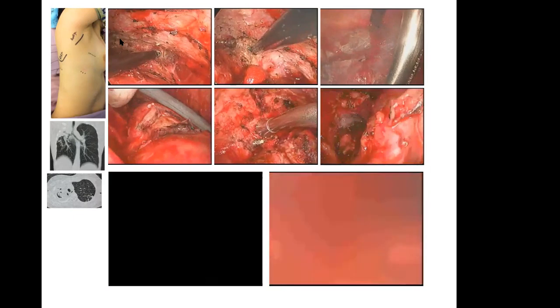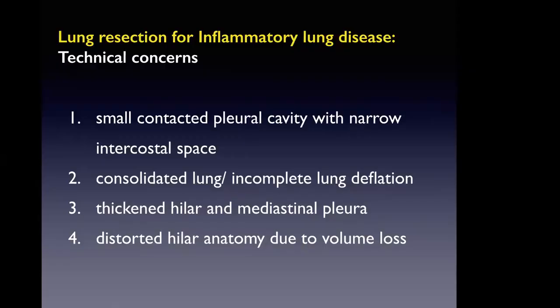Are you doing this uniportal or three ports? Well, we do add ports. If there's difficulty accessing the dense adhesions, we don't stick to just doing uniports. If there's a need for additional ports, we make it a two-port, and if needed, an additional port, like a three-port incision. But we usually do start with the uniport approach.